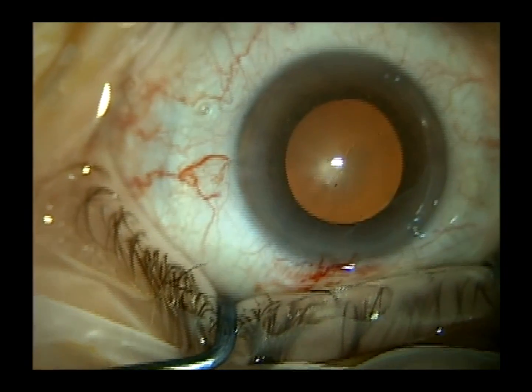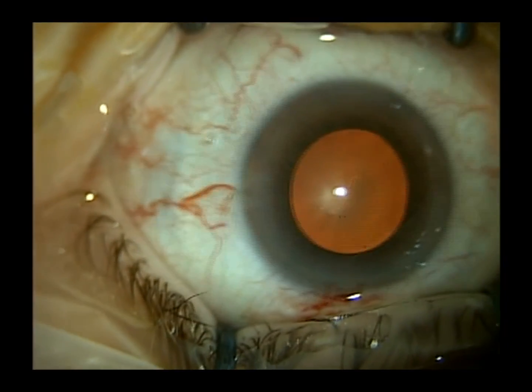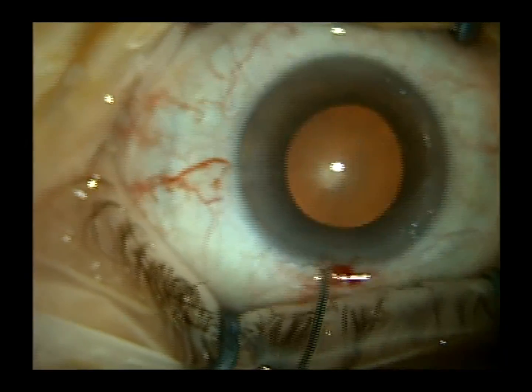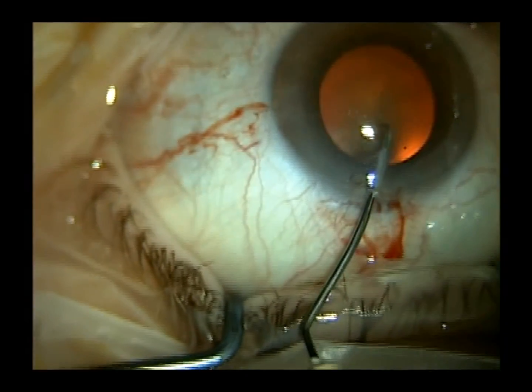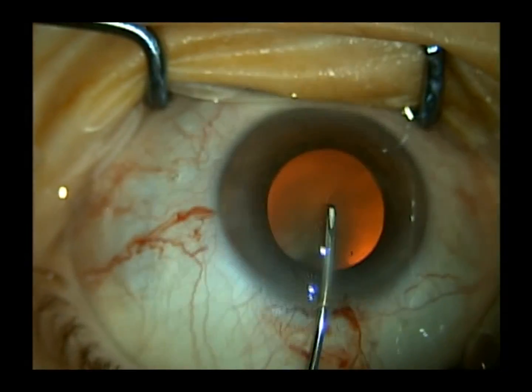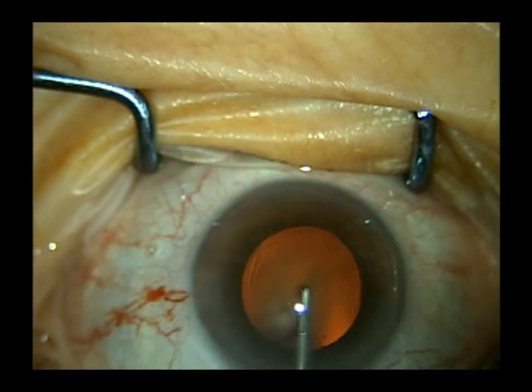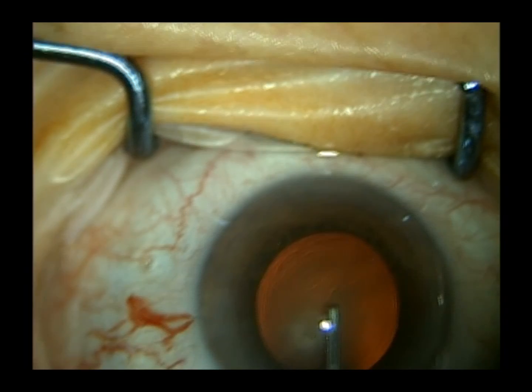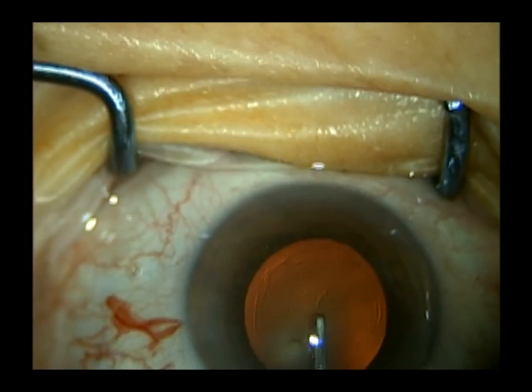So I use a bent needle cystotome attached to my OcuCoat syringe. Like most cases, I'll use one syringe of OcuCoat per case. I usually start in the center and then move my cystotome out toward 3 o'clock.